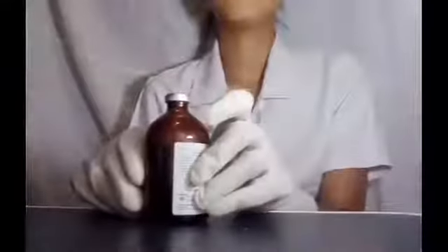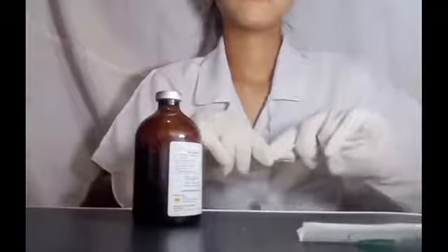Remember, when we're dealing with the vial, we have to check for the expiration date. I have here the vial. And the other thing I want to point out is, first, this is a tuberculin syringe. This is a very little syringe, and this whole thing is 1 ml.